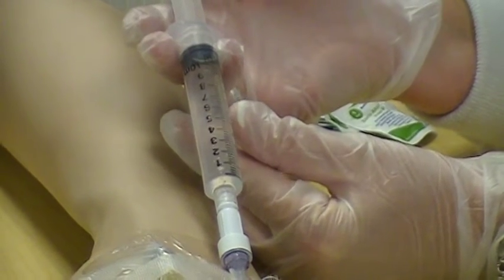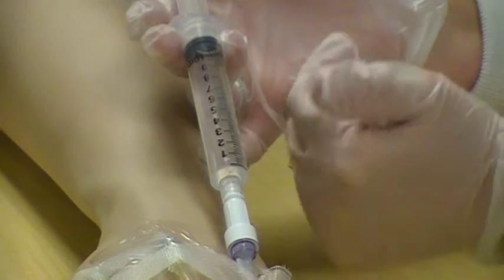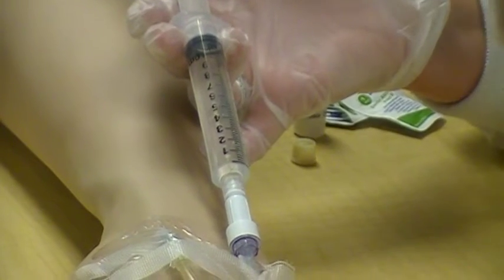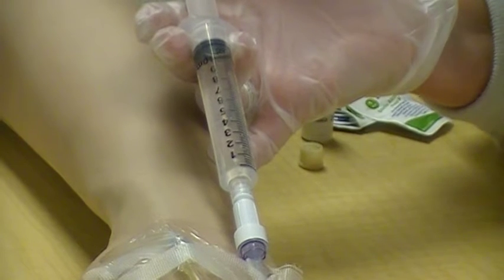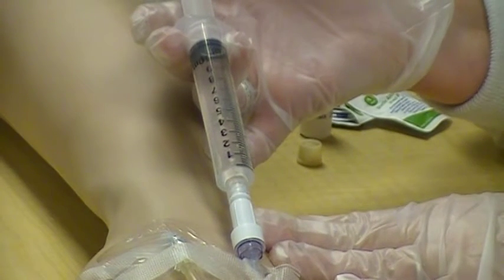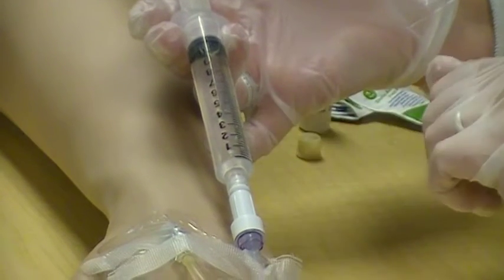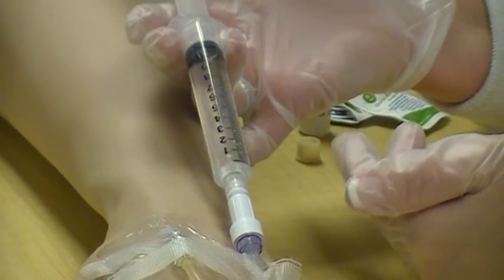What we want to feel for is a lack of resistance. If your IV is not patent, you will have difficulty pushing the medication. It'll feel like it's not going anywhere. So just really slowly we're going to push. If you do feel resistance, you want to stop, take the saline off, and restart your IV.